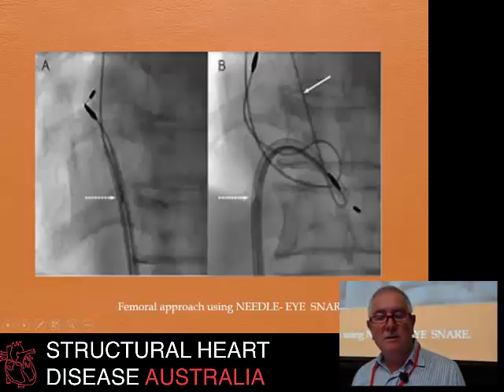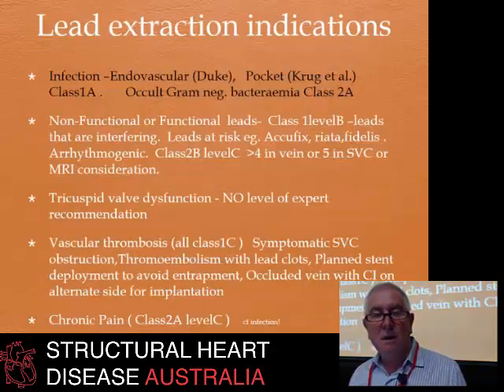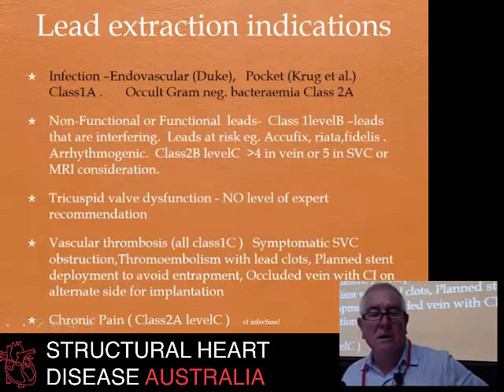And of course, every now and again you may need to use a femoral approach and use something like the needle eye snare. I've only used this in 2 cases, so it's not all that common in my experience. So what are the indications for lead extraction? Well, there's infection, infection and infection basically, and then there's a few other indications.